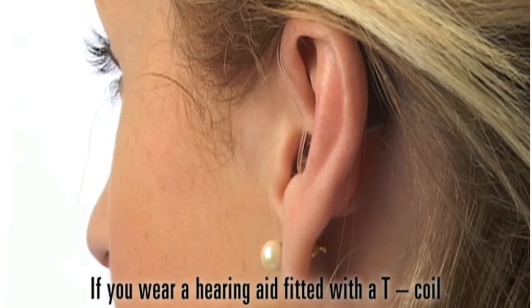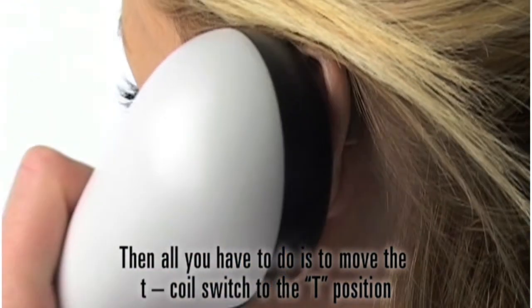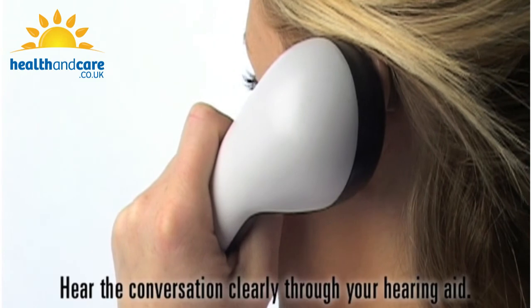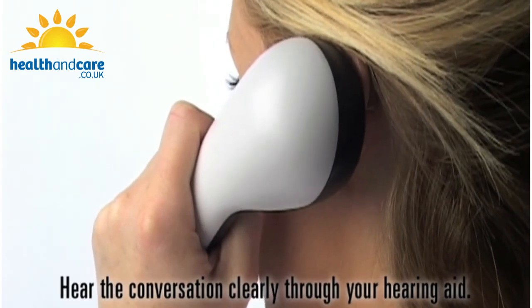If you wear a hearing aid fitted with a T-coil, then all you have to do is move the T-coil switch to the T position and put the handset next to your ear. Hear the conversation clearly through your hearing aid.